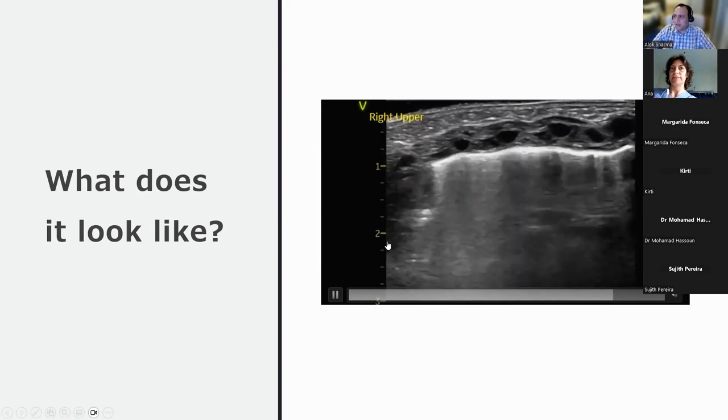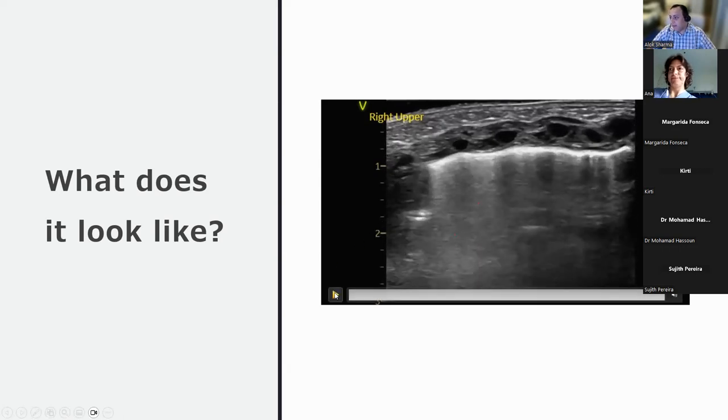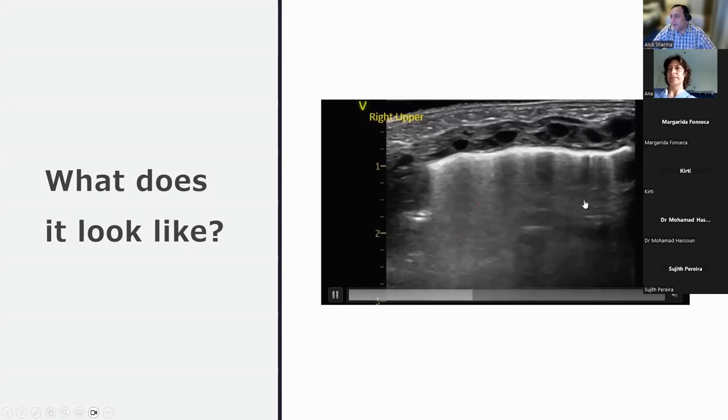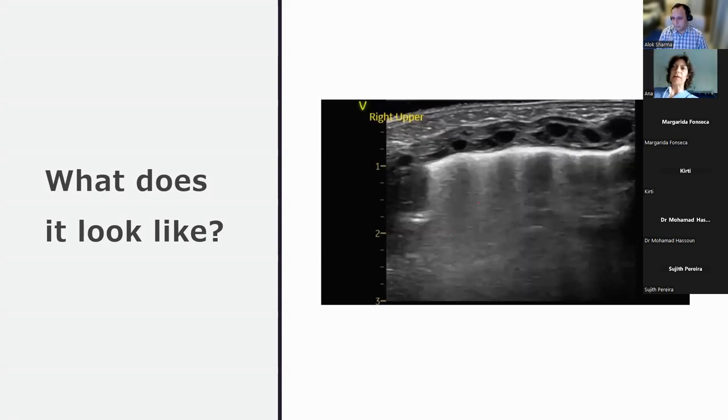Okay. Let's assume we've done the rest of the ultrasound and you've got a very similar aerated B profile. So this is nearly like a double lung point. You've got aerated lung at the bottom with a B profile over here. So in terms of diagnosis, what are you thinking? Maybe there is an atelectasis in the upper lobe of the lung. I would check the tube. Lovely. Beautiful. So you're absolutely right.